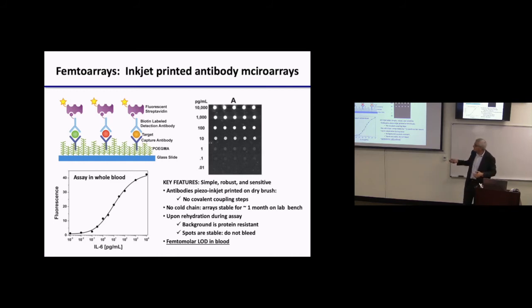And what you get is a dose response curve in blood that in the best case is in the femtomolar regime, which is pretty high, right? Sub-picomolar. We're talking things like less than picograms per mil for those people who work in grams per mil units.